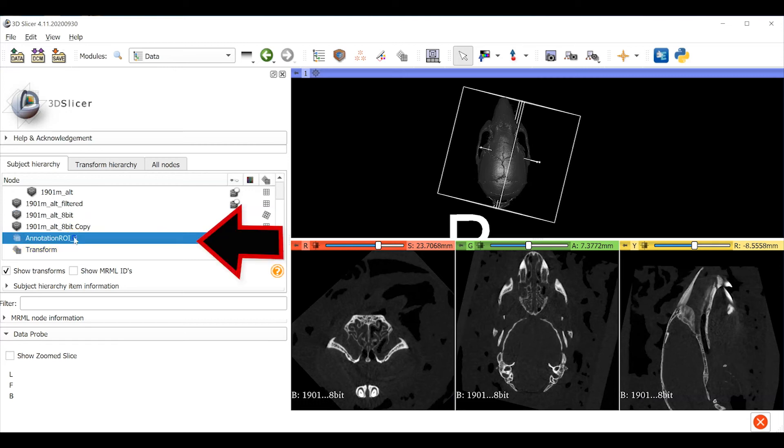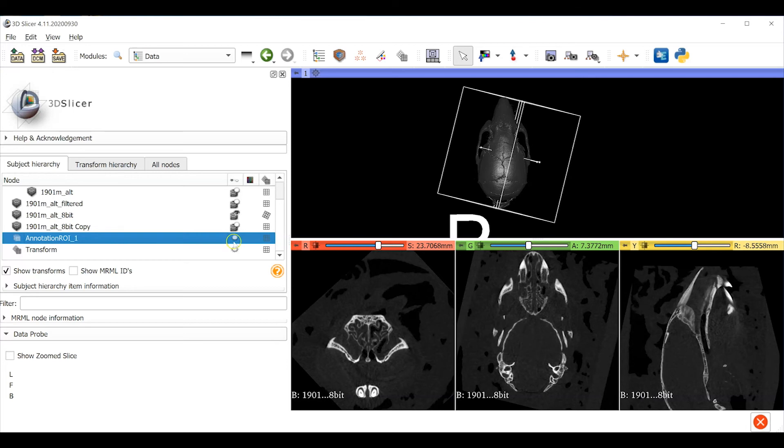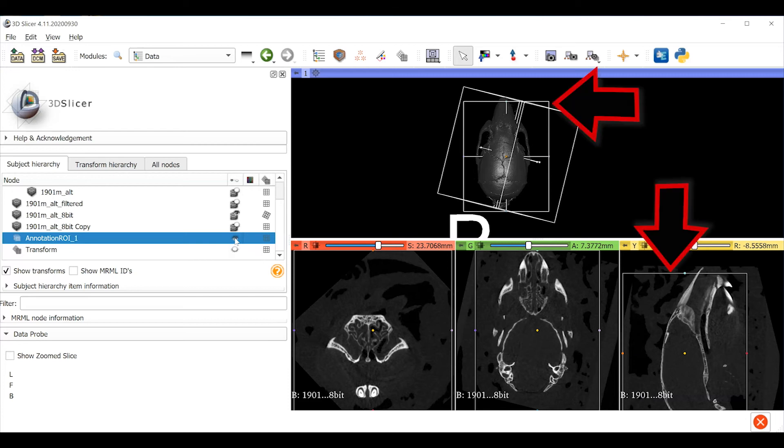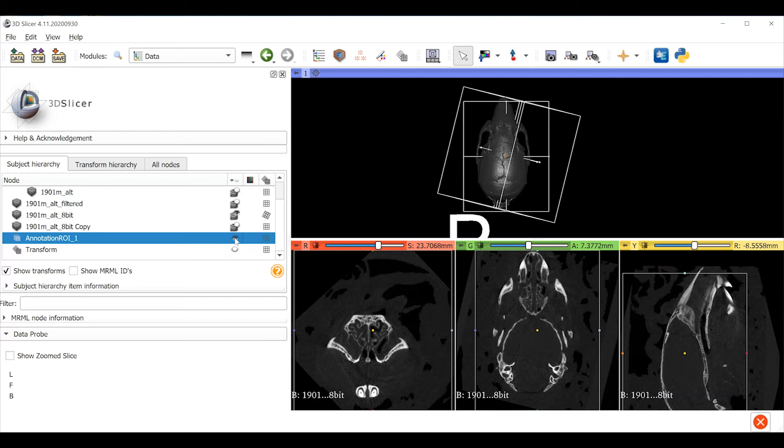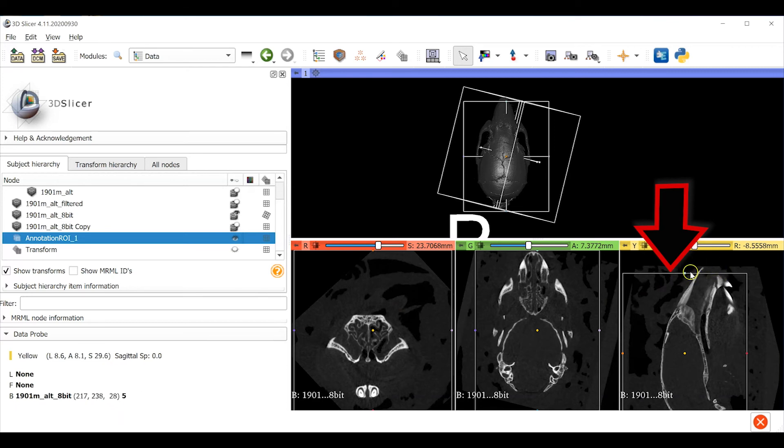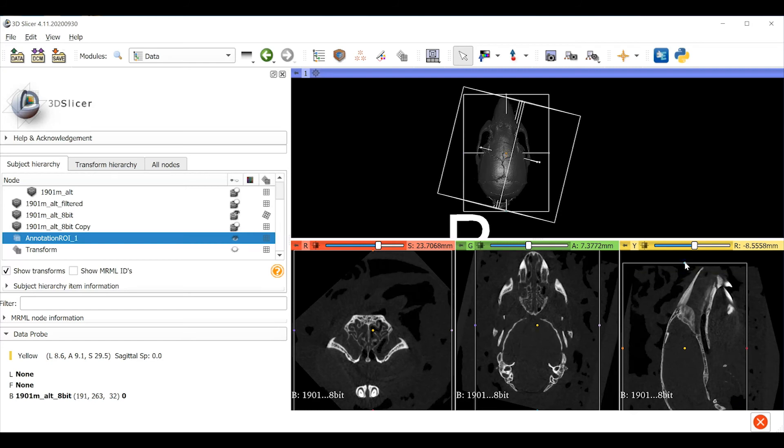Notice here there's this annotation ROI object. ROI stands for region of interest. We're going to use the ROI because it tells us the boundaries of the original image volume. In effect it's showing us the voxel structure of the original image. Click on the eye icon to the right of the annotation ROI object. This shows us the boundaries of the ROI in all of the viewer windows. We're going to use this ROI to set the boundaries of our new transformed object. In the lower right viewer you can see that the rostral edge of the ROI is cutting off the tip of the nose. You can click and drag the little handle to adjust that boundary.